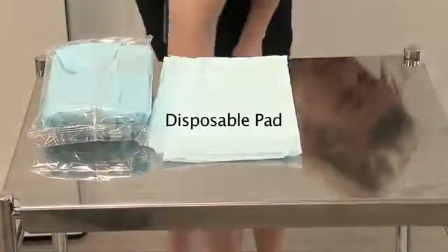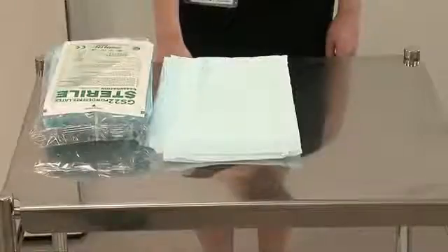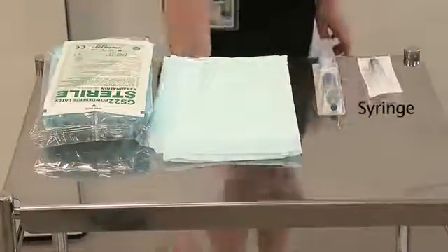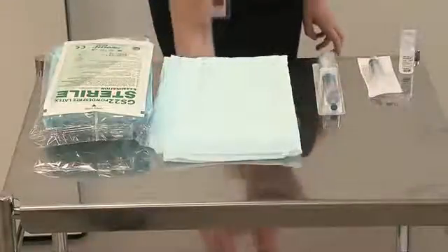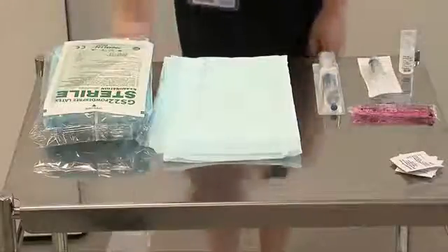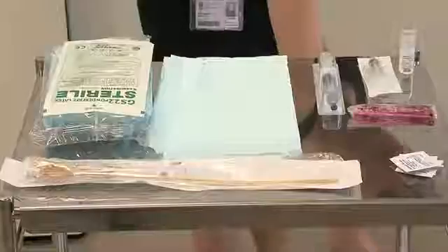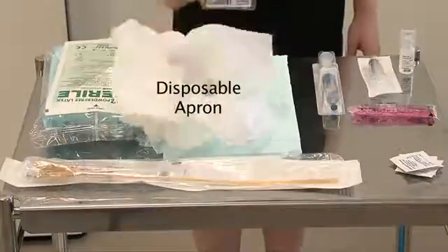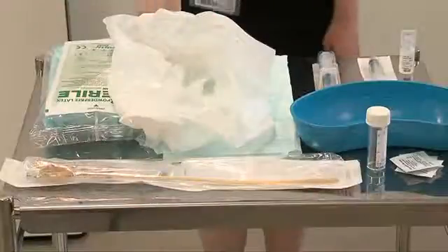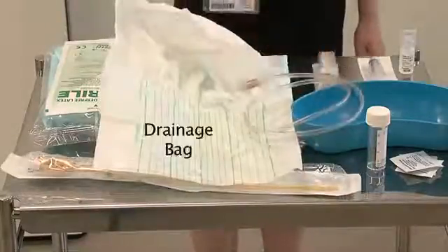Thank you. The following equipment is required for urinary catheterisation: a sterile catheterisation pack, a disposable pad, sterile gloves, anaesthetic lubricating gel, syringe, sterile water, antiseptic solution, alcohol wipes, an appropriate catheter, a disposable plastic apron, a clean tray, a universal specimen container, and a drainage bag.